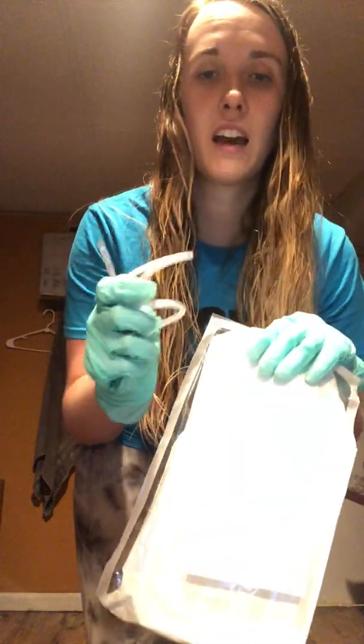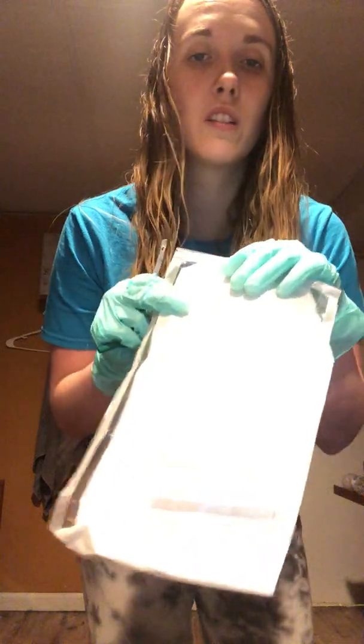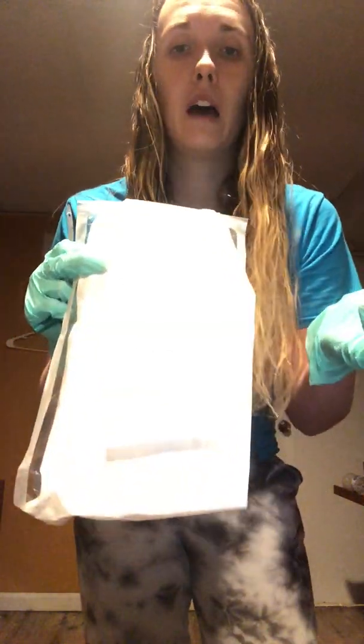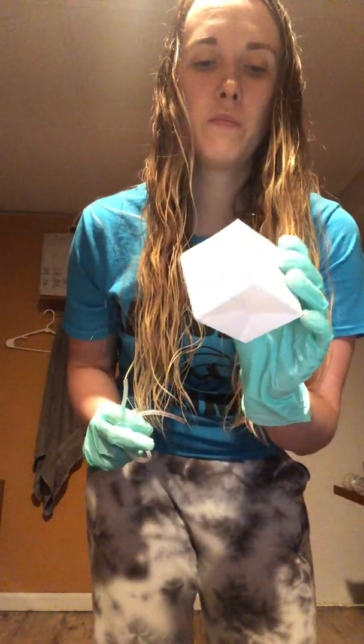I already have my catheter out. And in this kit is going to be your sterile gloves, which I already have on, but I'll explain that as we go through. Also in this kit is going to come a little basin. That's where we're going to put our sterile water. And then, of course, we're going to need our linen saver pad, which we've already placed on the patient.